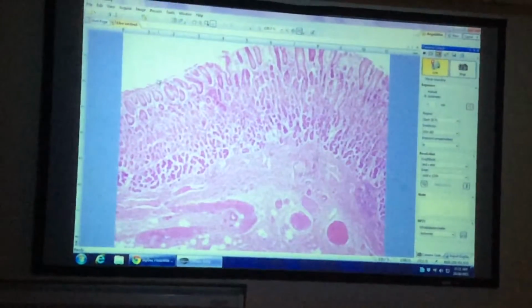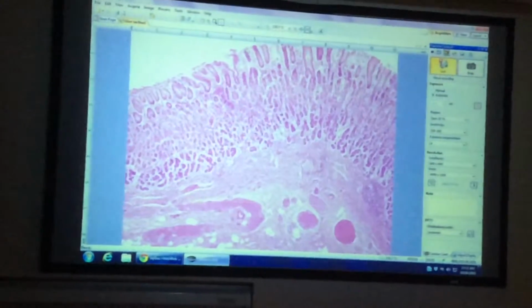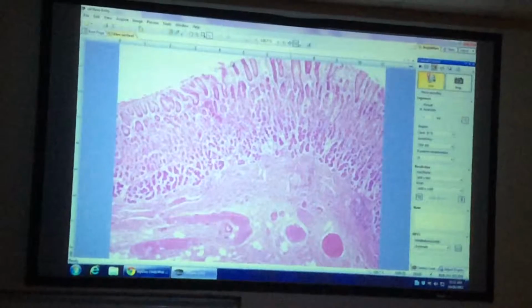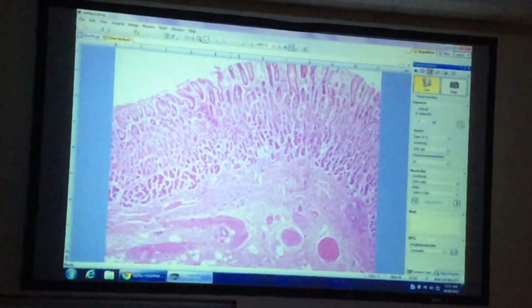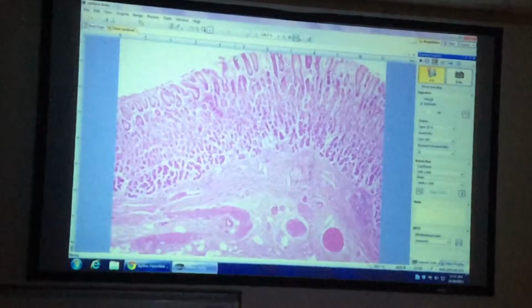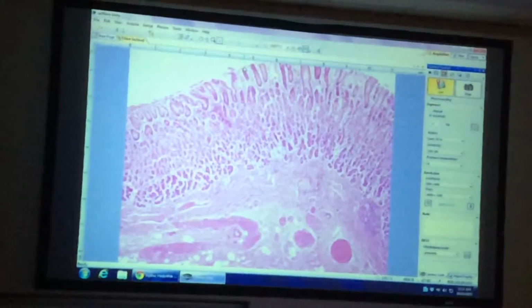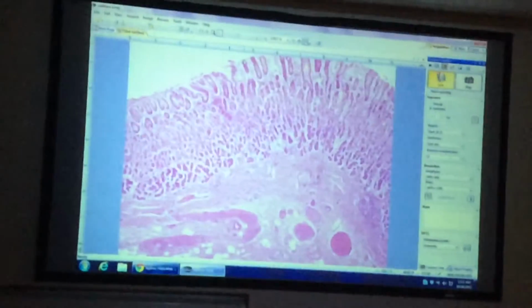Now the surface epithelium on the stomach is oftentimes ripped off on these slides. So see how there's no epithelium right here? There should be. Right? There would be epithelium there in real life. Of course, the whole thing would have to have epithelium on the surface. Just don't be surprised if it's ripped off in certain areas. Okay? So this is the surface of the stomach.